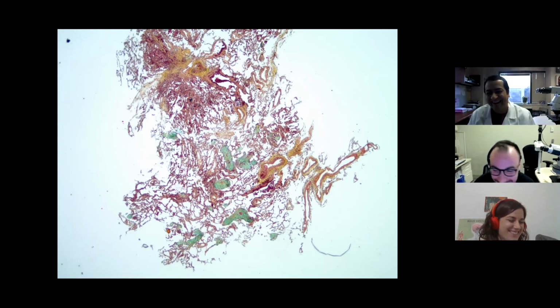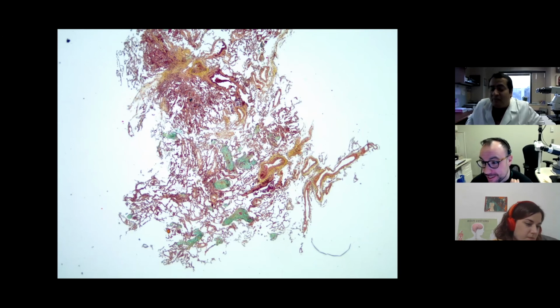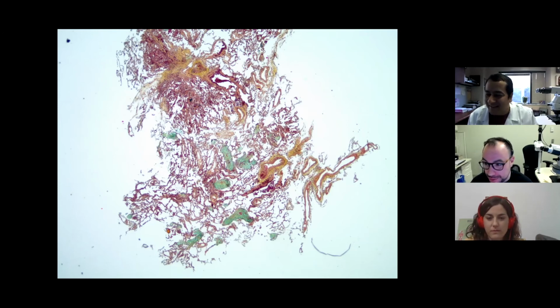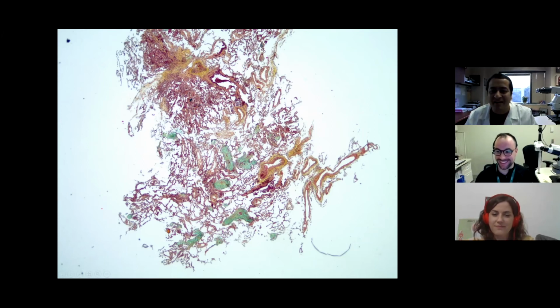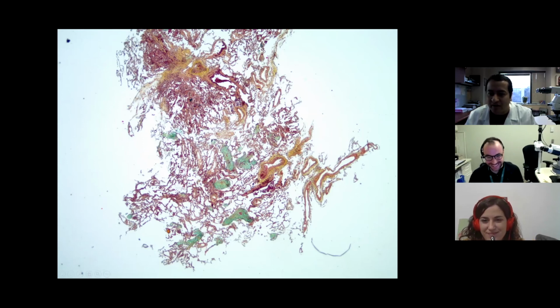I will get you started. I don't even make any diagnosis without looking at the CT. So yeah, I love the OP on Movat. It's absolutely so great, beautiful. And look at all the things that you described. Who showed the OP? Both of you did, or just Irene? Irene, right? All the things you described, Irene, are seen here: the various shapes, the clustering, the dancing plugs of fibroblasts, everything, and the close proximity to a bronchovascular bundle. All of it. So cool.